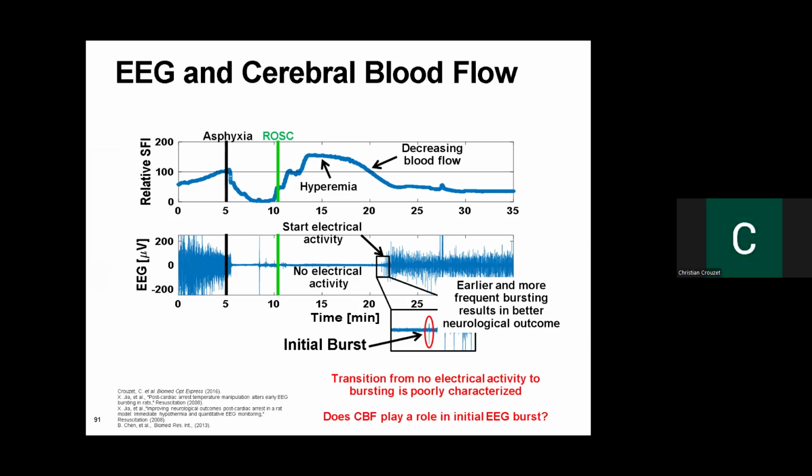So the question is, what is the wavelength and the optical power? So the big variability. The wavelengths that we typically use are the red to near infrared. A lot of our work has spanned from like 633 nanometers to 850 nanometers. Those would be the wavelengths that we typically use, kind of going into that optical window where the absorption is much lower. And then in power, there are safety considerations that you need to target.